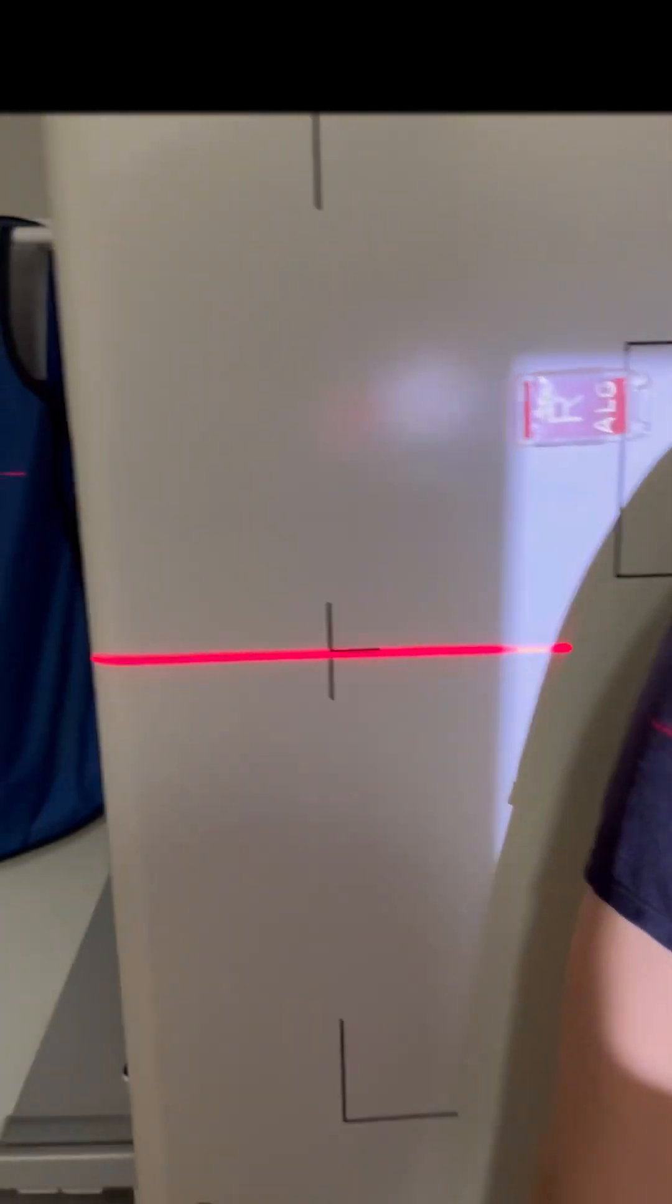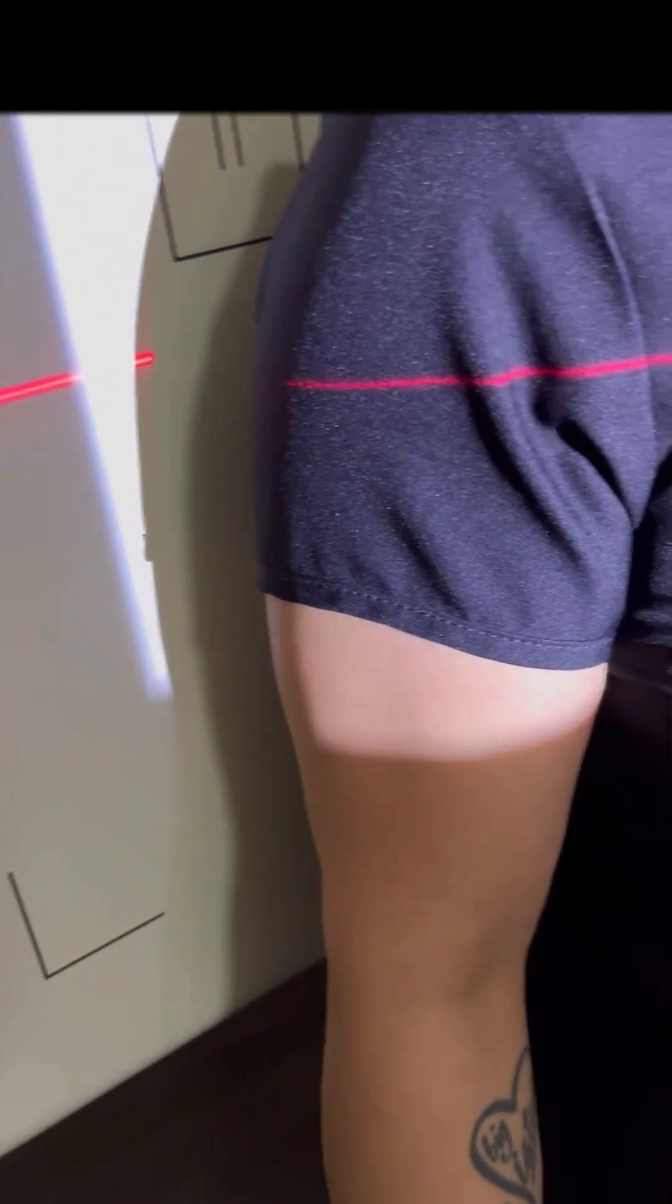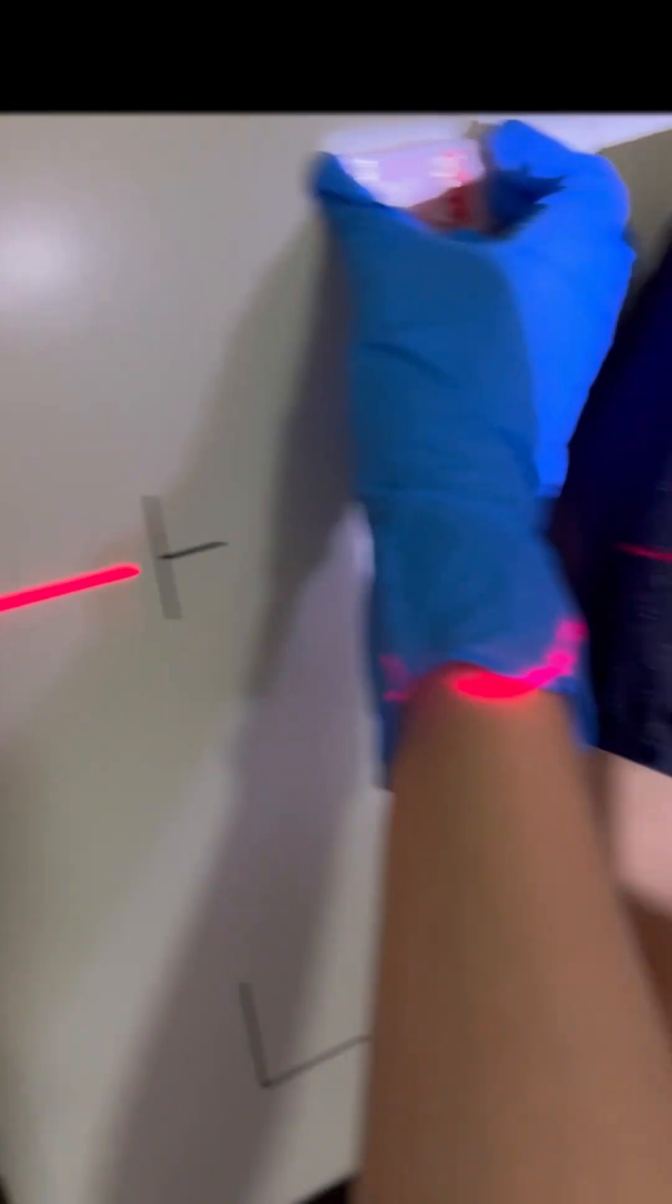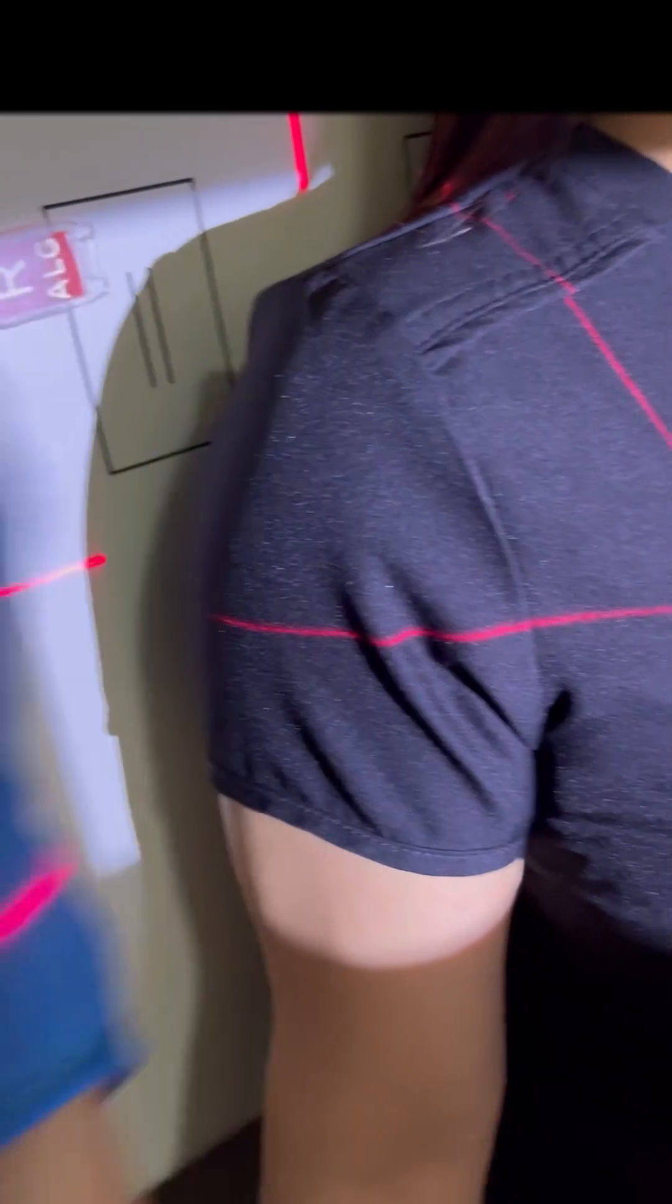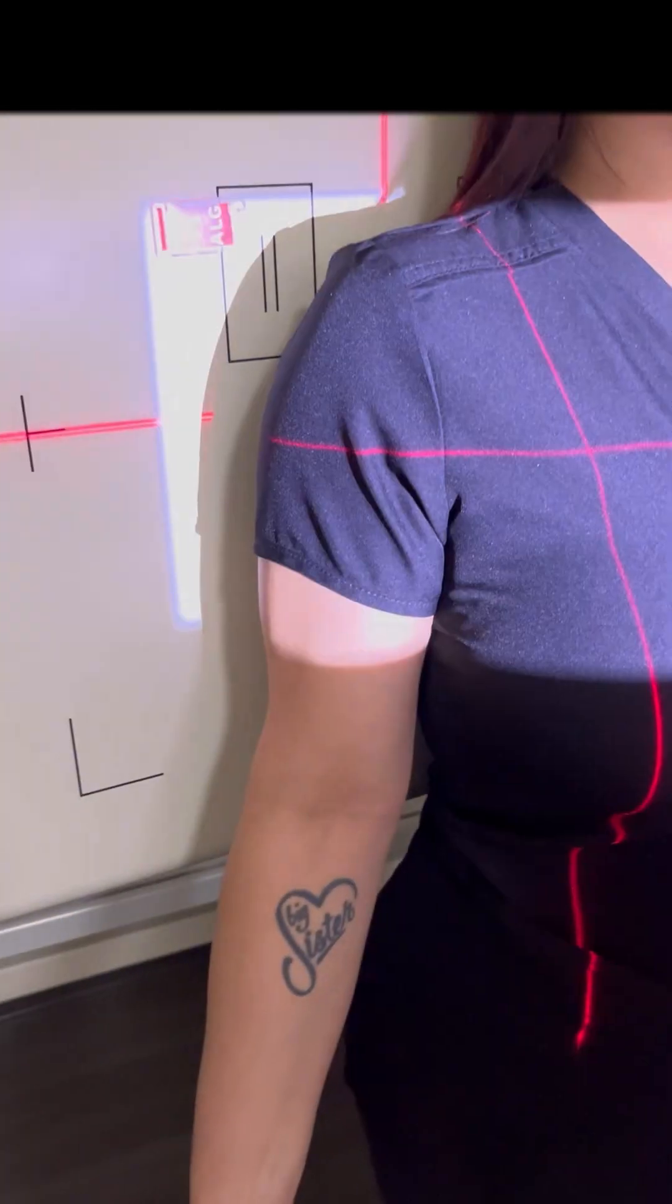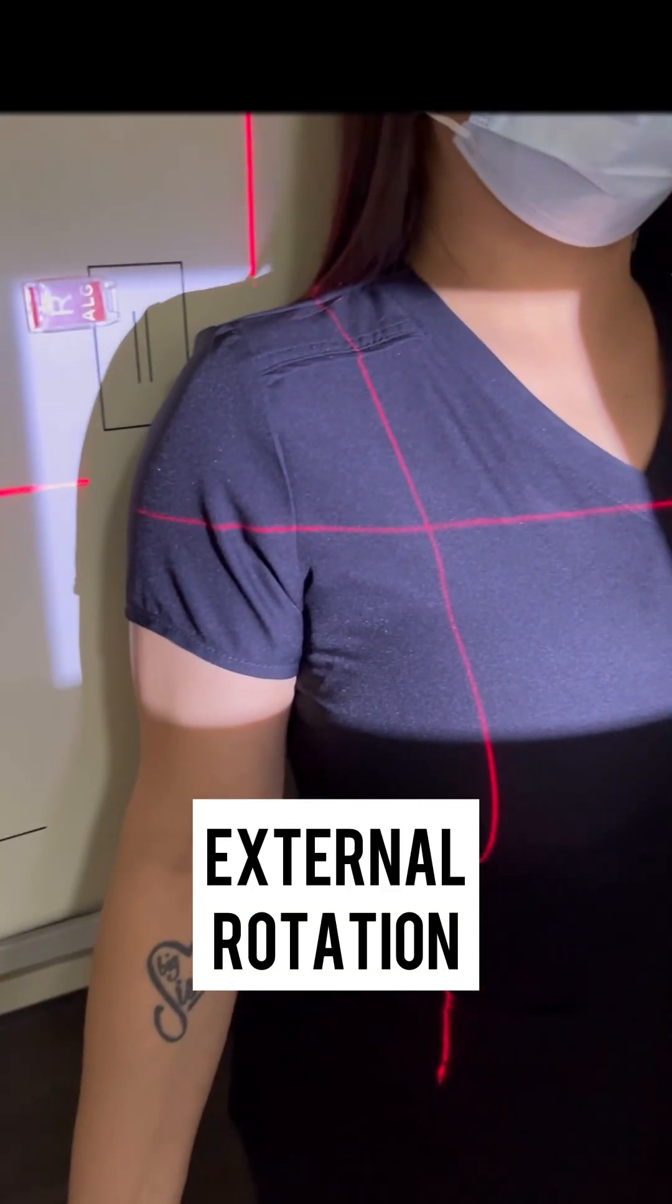For the external rotation, you're going to have your palm facing forward, and then you want to put your marker facing outward. That will be the external rotation.